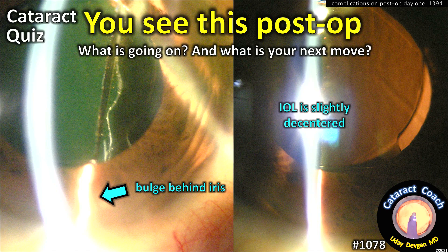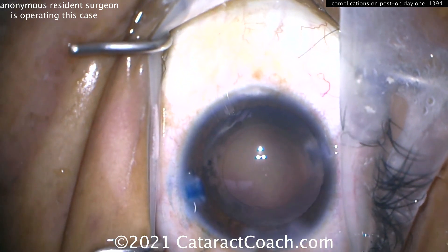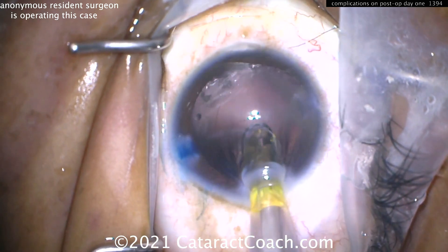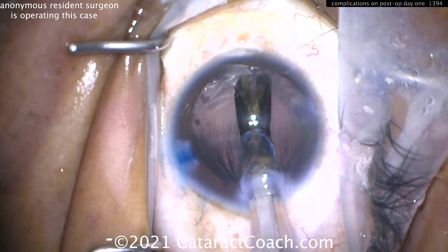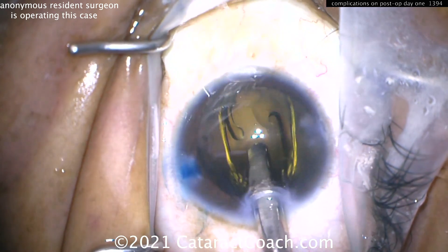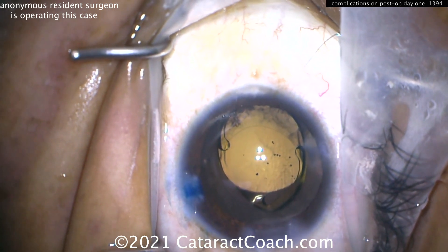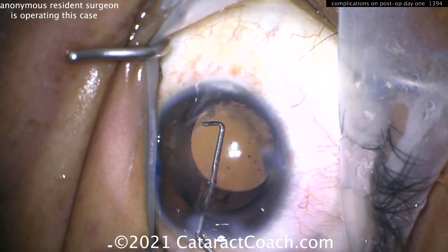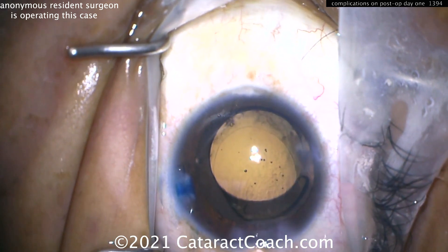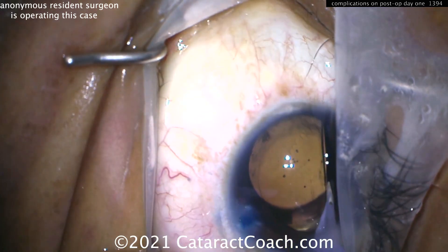Now let's talk about another case. On post-op day one there's a little bulge behind the iris. An anonymous resident is doing this case — let's watch carefully. The resident implants a single-piece acrylic lens in the capsular bag. It looks like a routine case with a nice-looking rhexis. The lens is nicely placed in the bag, and now the resident helps get those haptics opened up and dials the lens into position.